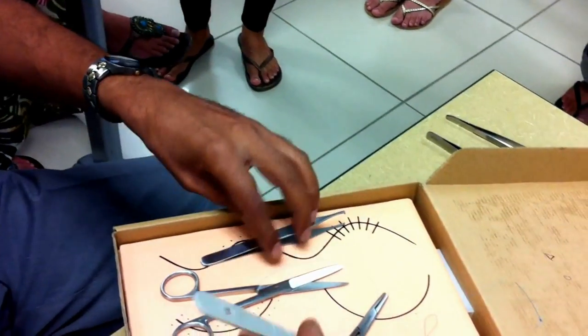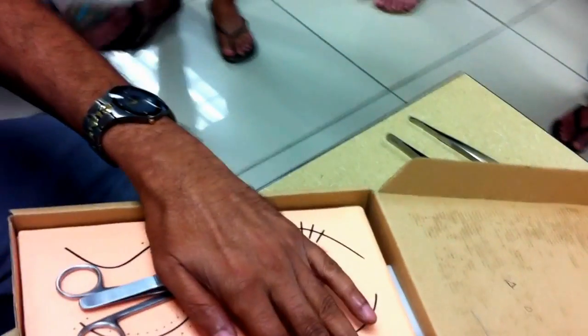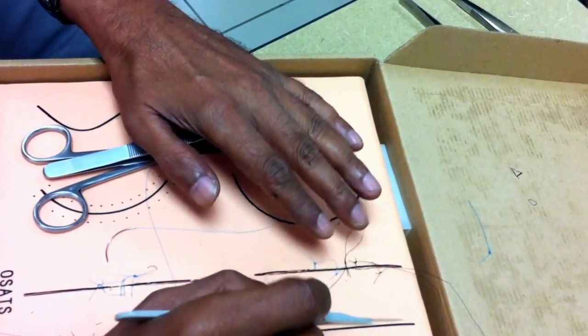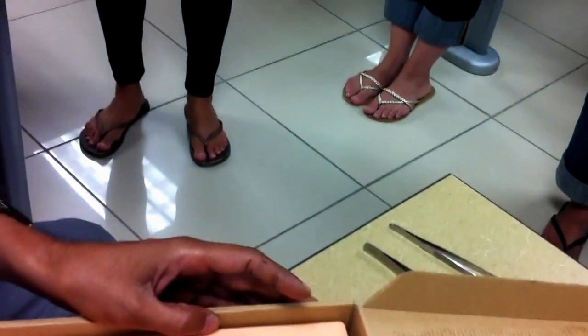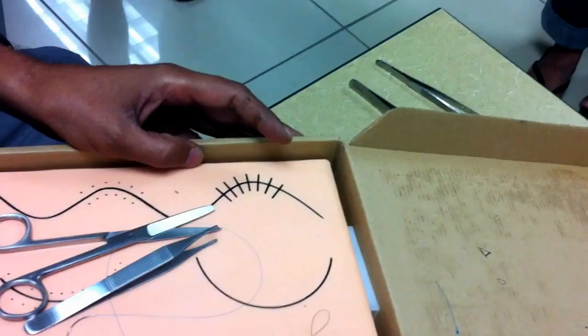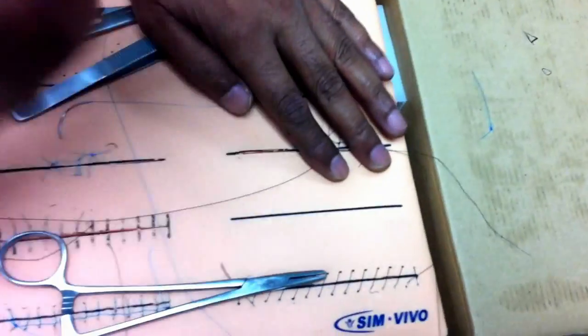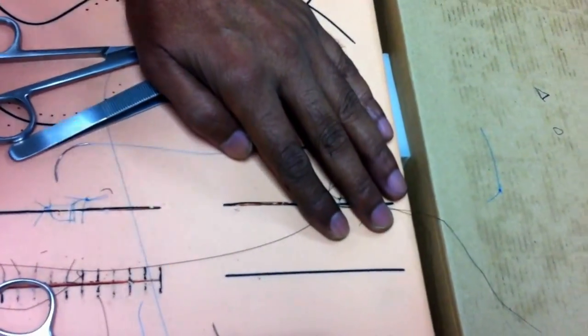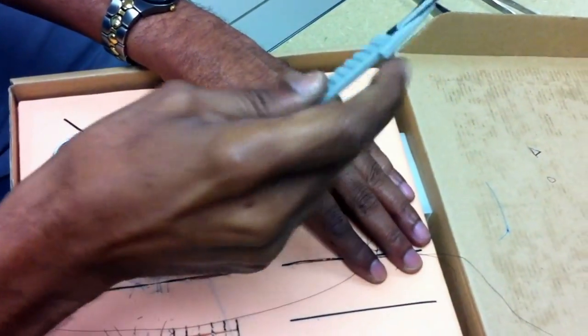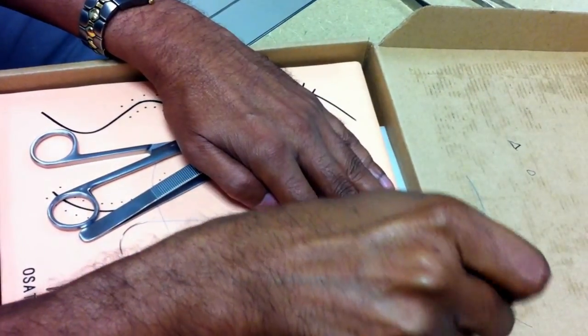Okay. So now, first I'm going to show you how to make a simple incision. And after that, I'm going to show you the simple interrupted suturing technique. When you make an incision, hold the Bard-Parker handle like you're holding a pen. Not like you're killing somebody, like in a B-grade Hollywood or Bollywood movie, or like a mafia. We hold it like a pen.